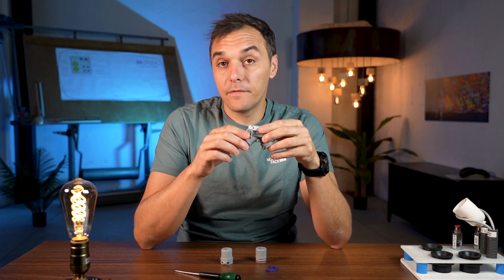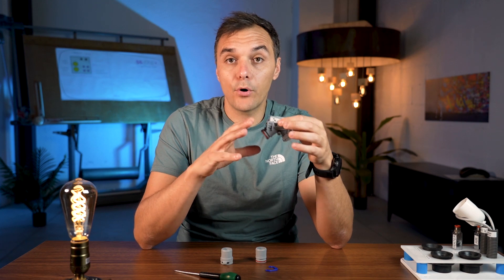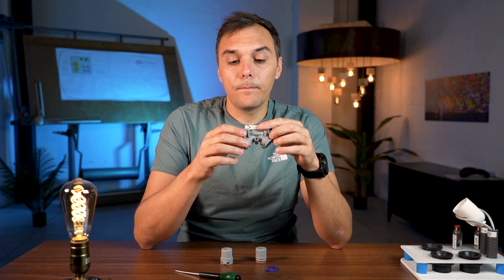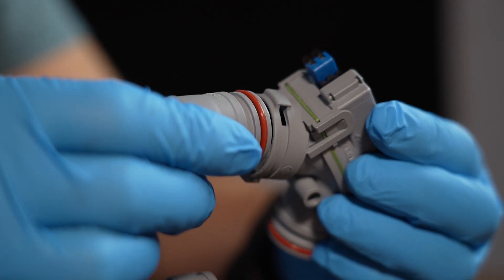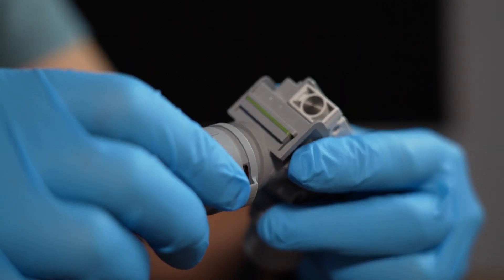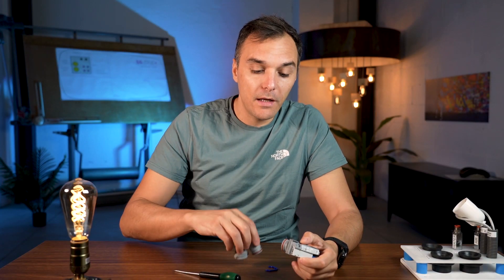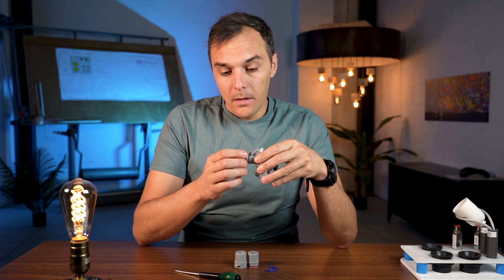Regarding installation, it's very easy but we need to follow a couple of steps to do it properly and avoid problems. When you receive this valve with our dental chair, the connectors are already included. However, if you buy the valve separately, connectors are not provided — so remember to buy them together with the valve, otherwise making the connection is not easy.